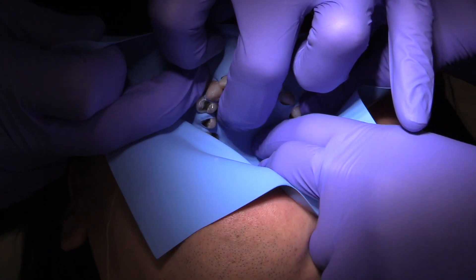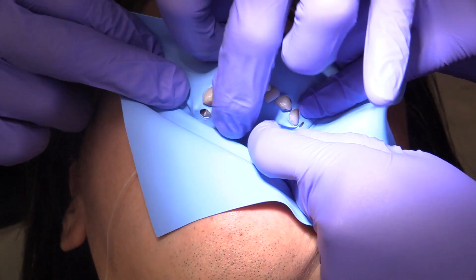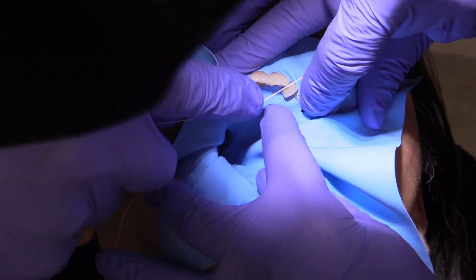Some people like to only isolate a few teeth, but I found that to be very limiting. Because oftentimes I'll use a microscope, it's nice to have a wide area where you can have the scope go in different angles.